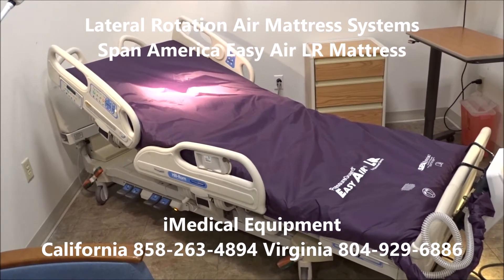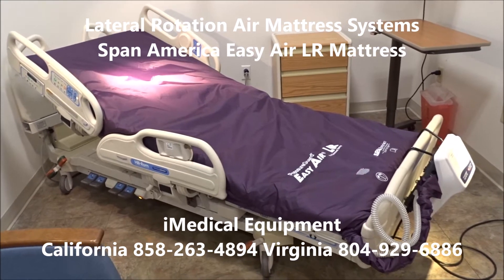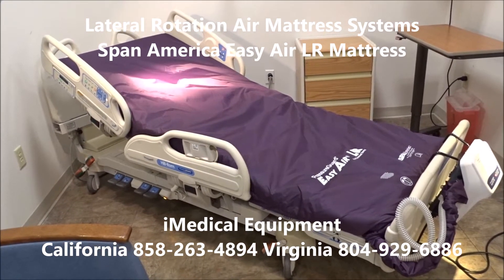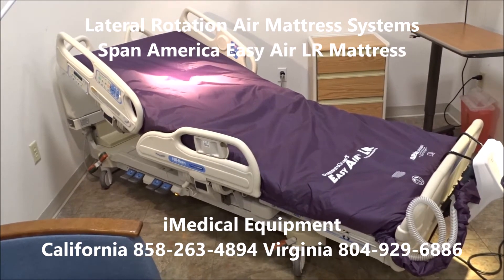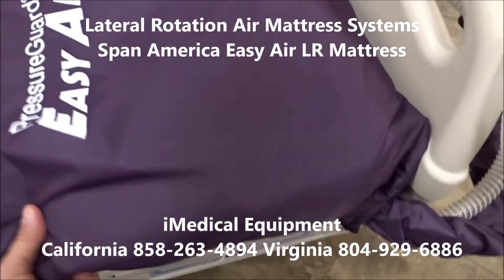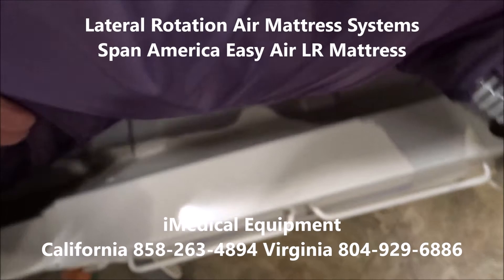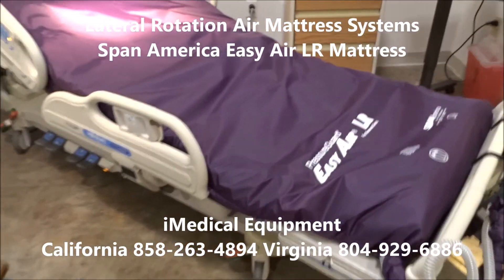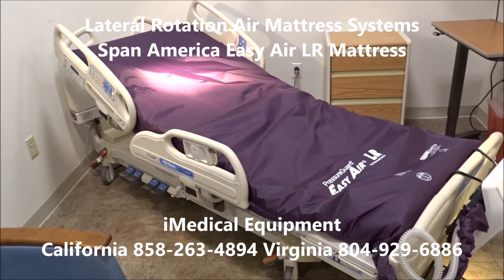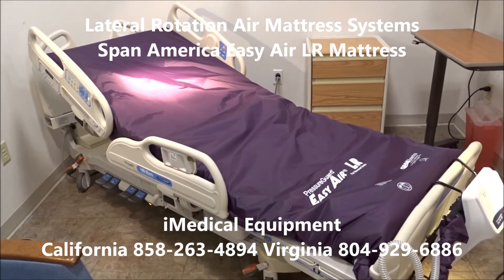It has a chair position, Trendelenburg, reverse Trendelenburg, and obviously power up and down. I'm going to put some pictures of the bed at the end of the video so you can see the different features. It sits low to the ground, it has a V-shaped bed deck — basically it kind of dips down — and the mattress also has a piece of material that sits in there, so it's specially made for the VersaCare bed.